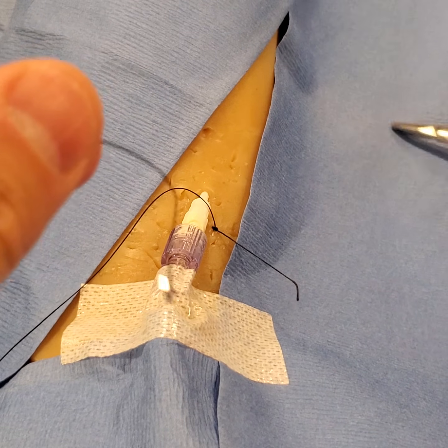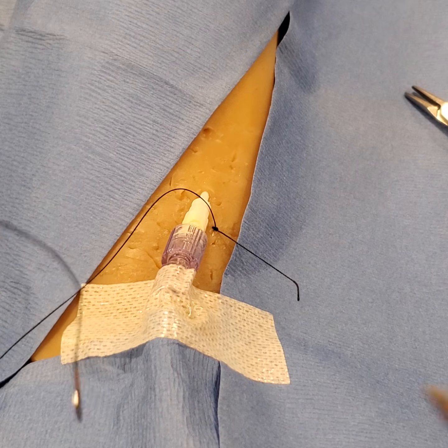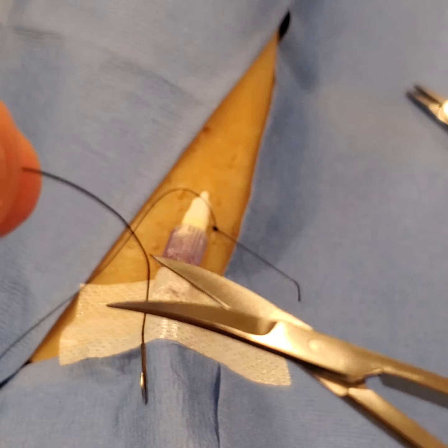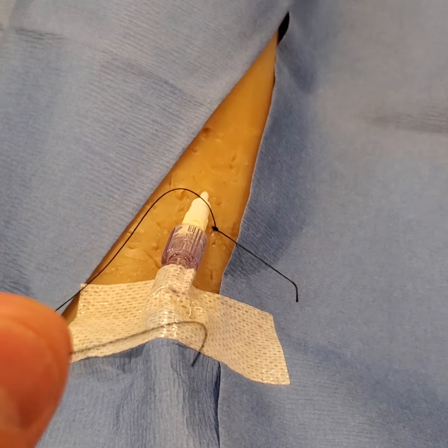For the rest of this, you don't need to go through any more parts of the skin, so I recommend cutting the needle off and putting it in your sharps container.